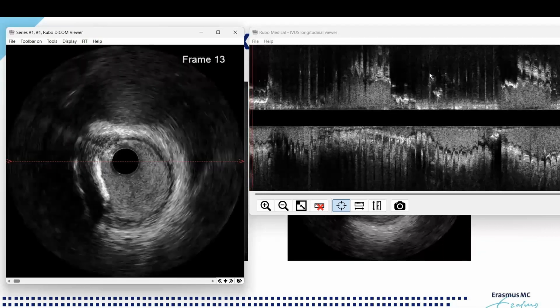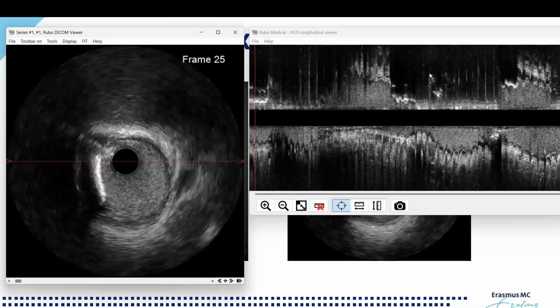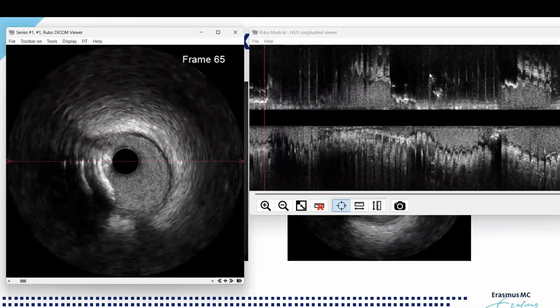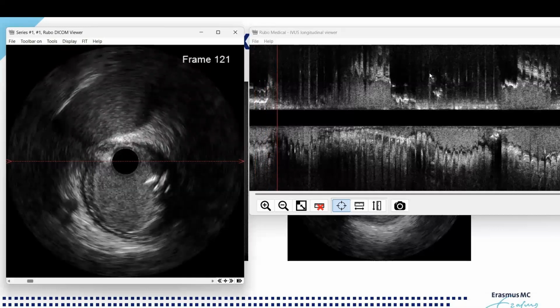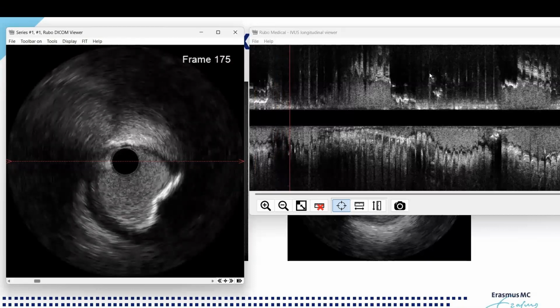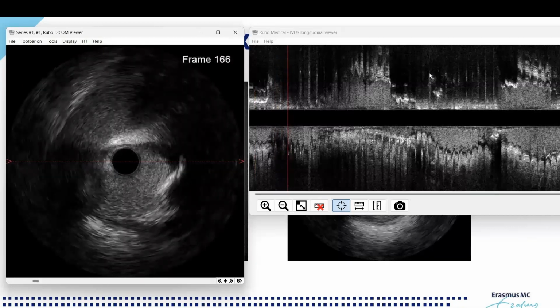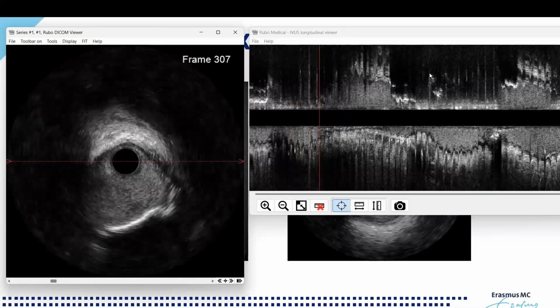It will never be a complete quantified stuff. So we continue to proximal, and you see that the calcium is still there. And here we have an eccentric, more mixed plaque, also calcified. It starts already to look a little bit like a calcified nodule that comes inside in here. Not the nicest one that you saw on the former slides.